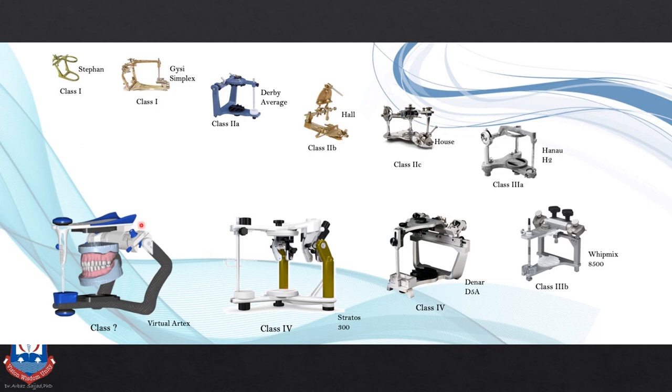And nowadays, because we have virtual impressions, virtual planning of any type of process, and digital CAD CAM milled dentures and ceramics such as zirconia, Emax, Empress, all these things, we also have something called a virtual articulator. So that brings us to the end of our lecture.